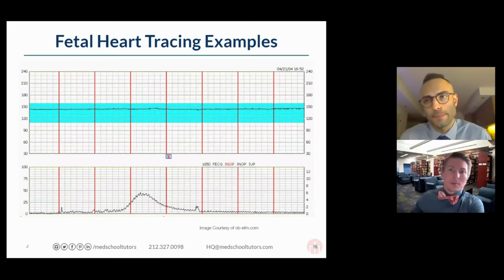So if the baby's asleep then, and here's your wake up call to the students here, what was the thing we would do to wake the baby up if we wanted to? I said it once early in our conversation. I like that pause. Yeah, it's a good answer. All right, I've got everything from buzz to acoustic to vibroacoustic to vibrations. Vibroacoustic stimulation is the full term.